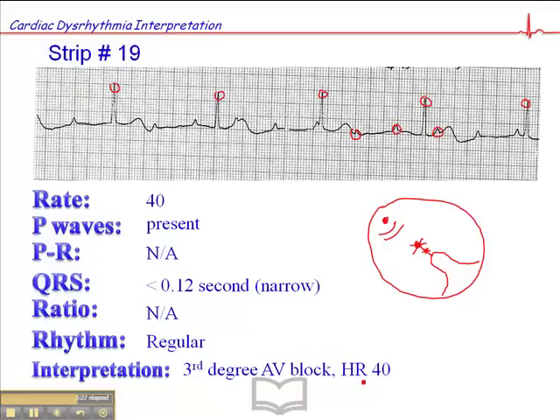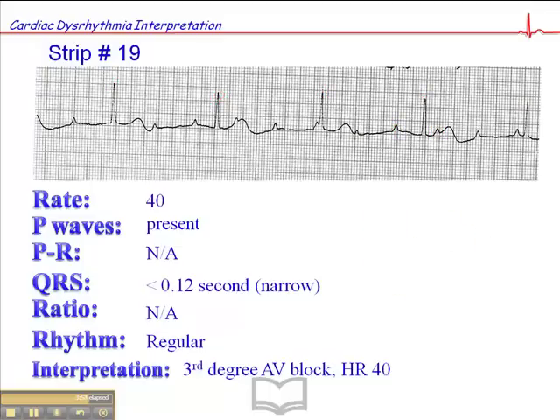The heart rate in this third-degree AV block is slightly on the high side because the range is typically 20 to 40. But that higher heart rate is fairly consistent with a focus that's up higher. And sometimes when you do see narrow QRS complex third-degree AV blocks, the heart rate may even be higher — at 60 or so — because the focus is coming from so high, around the bundle of His or the perinodal tissue, but somewhere below the AV node. So this is an interesting case of a third-degree AV block with a narrow QRS complex.